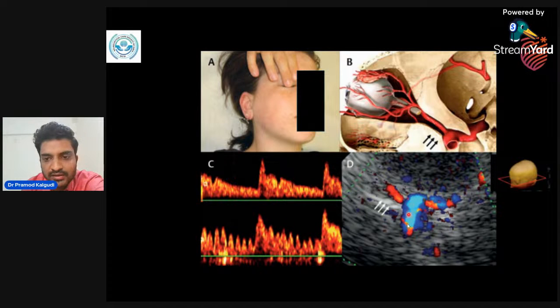So this is the carotid siphon. As we know, the ophthalmic artery arises from the carotid siphon. So you do an axial plane, get an MCA window, tilt it downwards, and then you see your carotid siphon this way, and there is something arising from the carotid siphon. So you put your pulse wave Doppler here and just gently tap on the eyeball. That gives you a pulsatility that will confirm that this was the carotid siphon behind this.